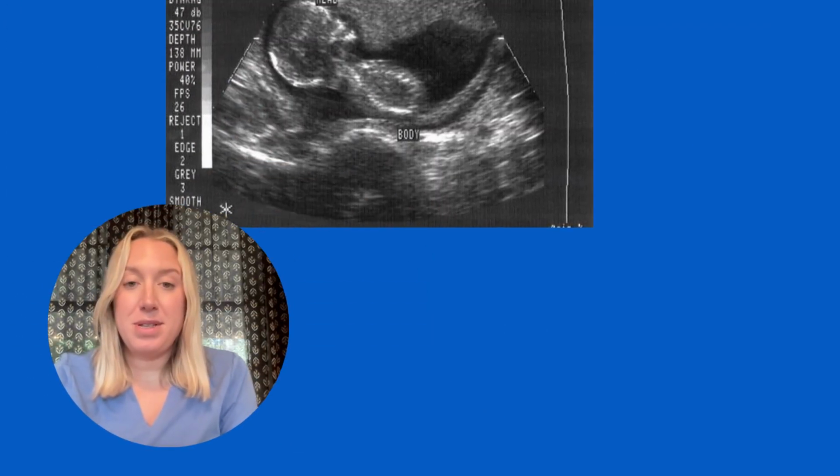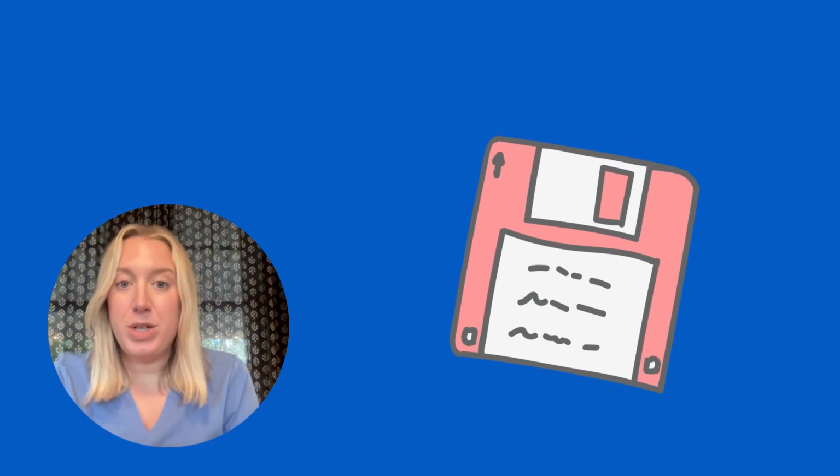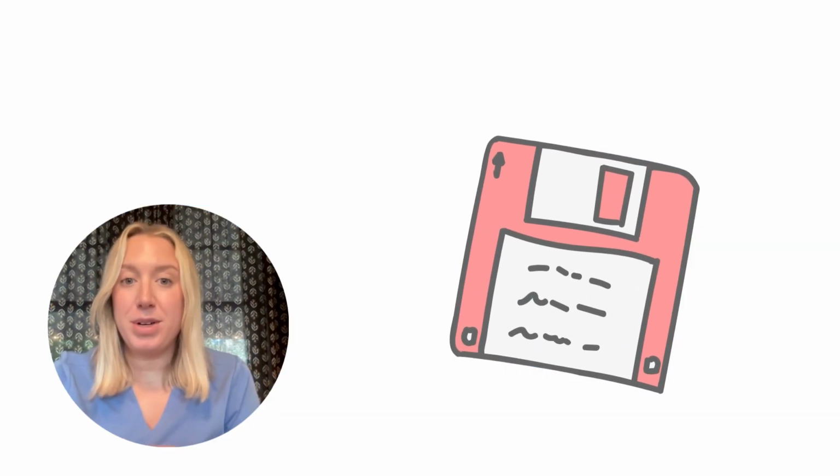Finally, your image can be stored and saved in a PACS system, which allows it to be digitized and saved in a larger computer network. This is regulated by DICOM, which stands for Digital Imaging and Communications in Medicine.